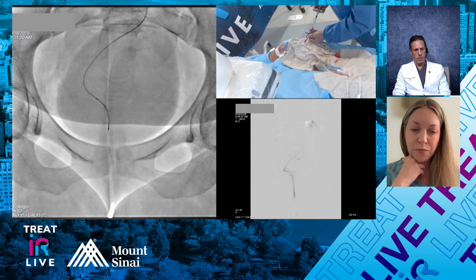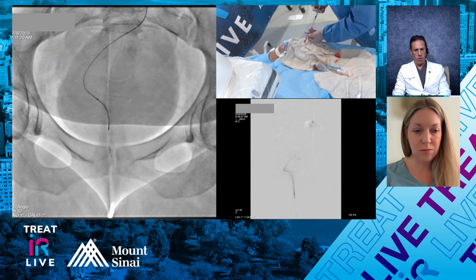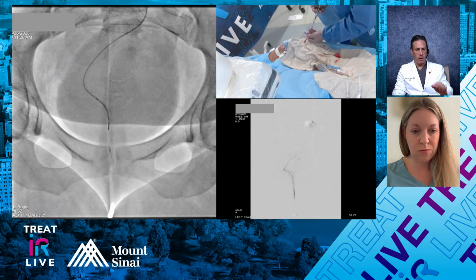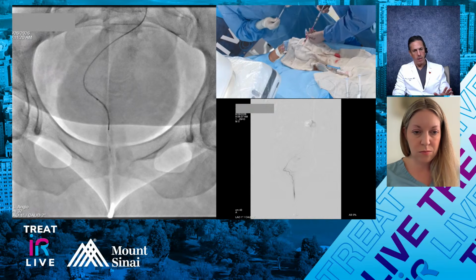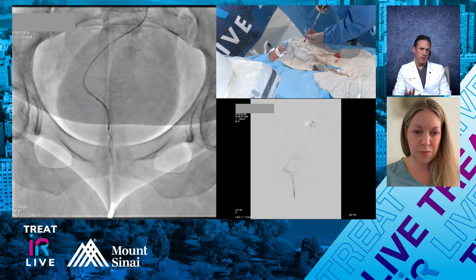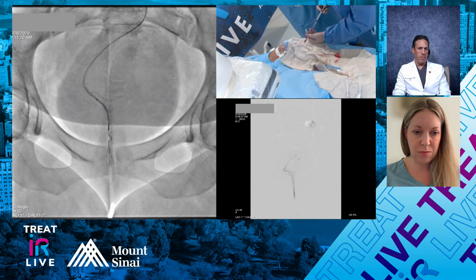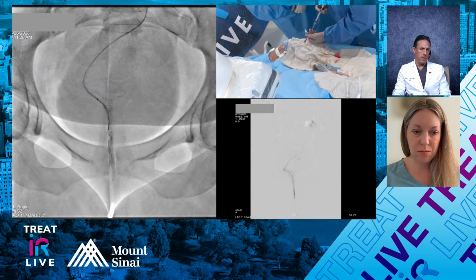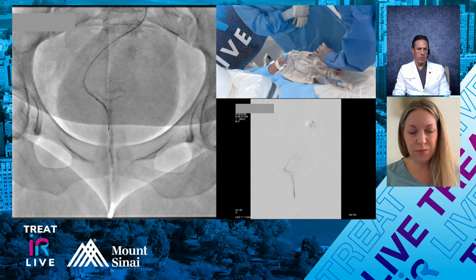As you guys deliver those, I'm just going to ask Jesse another question. This location, very proximal to the CCR, seems like, in my opinion, the best location. But as Jay was mentioning, there's lots of people that embolize much more proximal. So, have you found, at least in your experience, that putting a small coil here gives us the best possible outcome and maybe decreases the potential risk of recurrence? Or do you think it really doesn't matter too much?